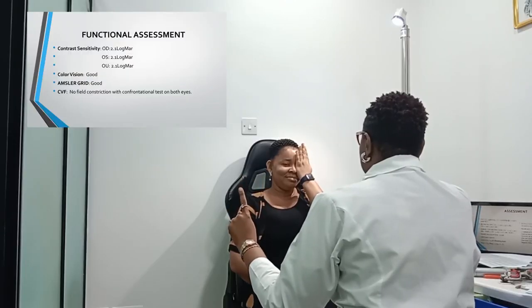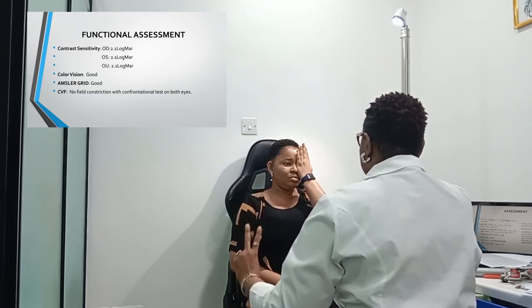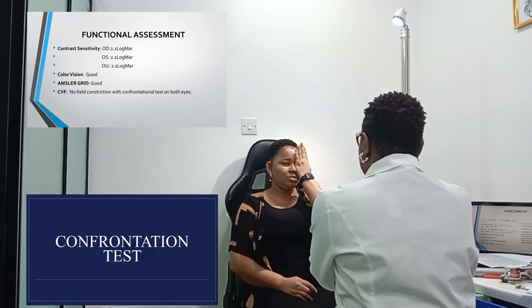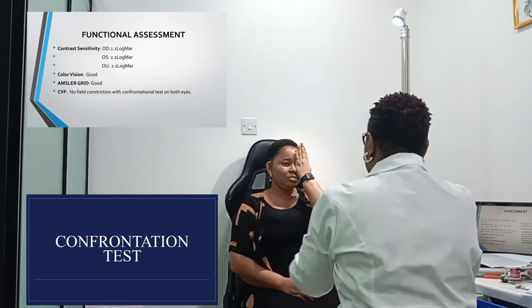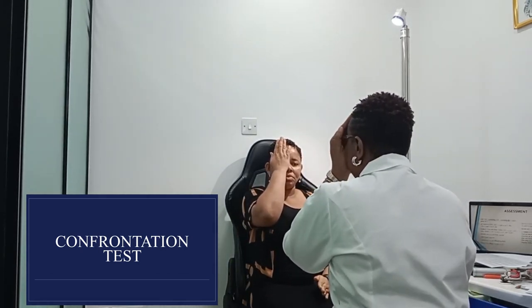How many fingers are you seeing here? Close this eye. Look at the nose.